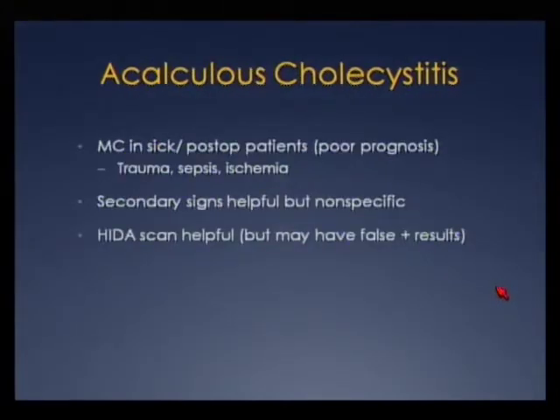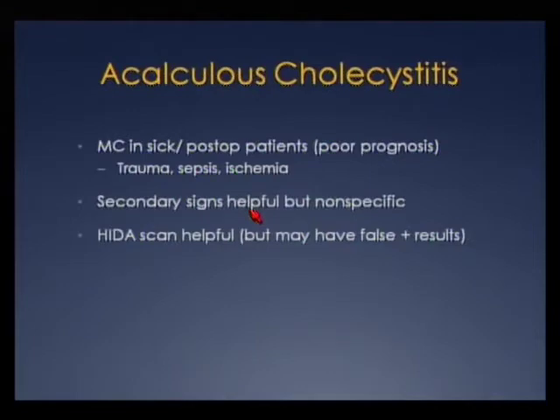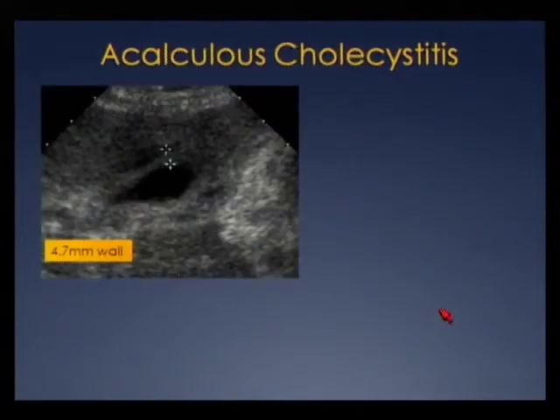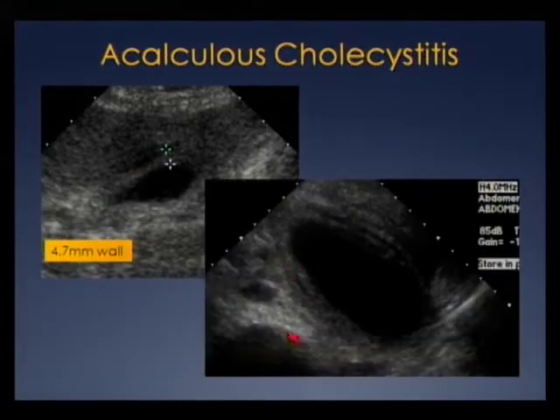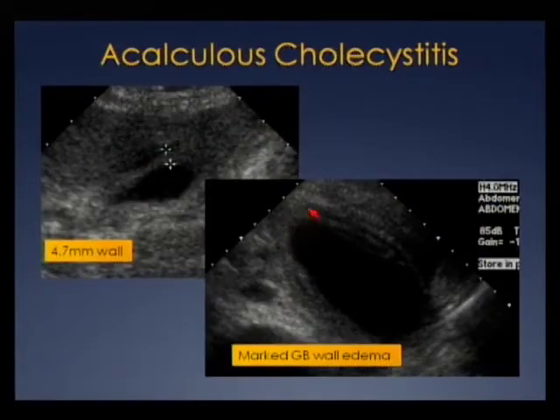Acalculous cholecystitis typically occurs in sick or post-op patients due to trauma, sepsis, or ischemia. Secondary signs of cholecystitis can help decide if you have acalculous cholecystitis, but they're not always specific, and HIDA scan can be helpful though may give false positives. Here's a patient with signs and symptoms of acute cholecystitis — thickened gallbladder wall, pericholecystic fluid, but no stones — called acute acalculous cholecystitis. Here's another case showing marked gallbladder wall edema with typical clinical history.